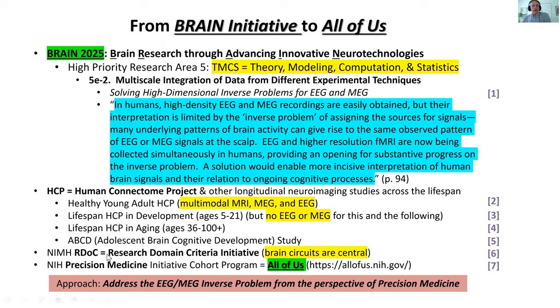So that's one. But although I emphasized NIMH, by far the most common utility of this today would be neurological, would be epilepsy. Epilepsy uses EEG brainwaves. Some places also have MEG. To get to the activity that's in the brain, they often will implant. If it's a serious case that's not managed by drug therapy, then it's sometimes necessary to have an invasive measurement, cut into the brain and put a grid somewhere and actually record in the brain to find out the so-called focus or epileptogenic zone.